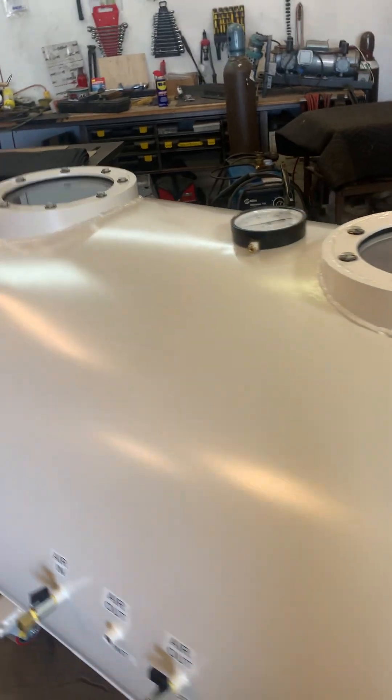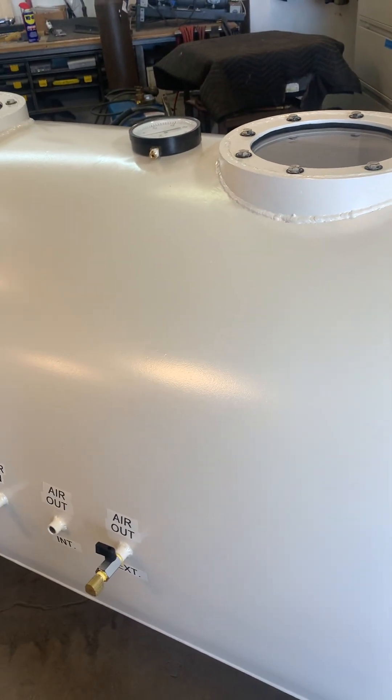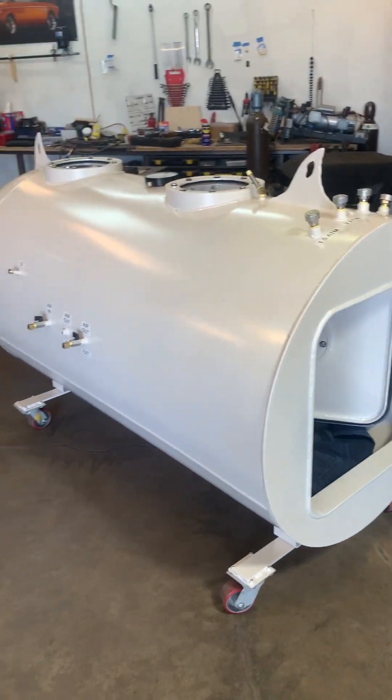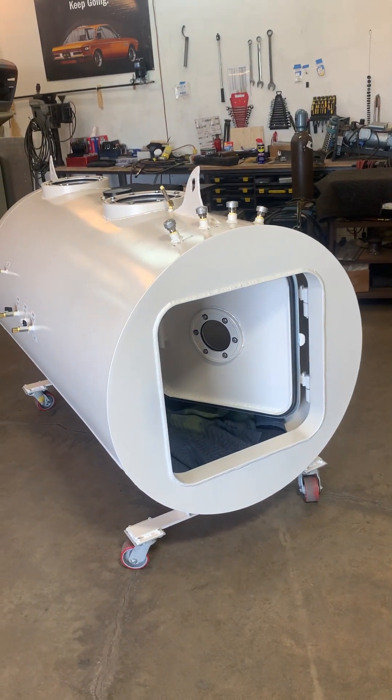So that's pretty much it. If there's anything else, I'll let you know. That is my final build minus a couple of pieces — take care.